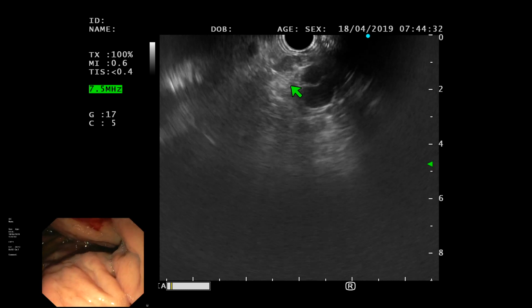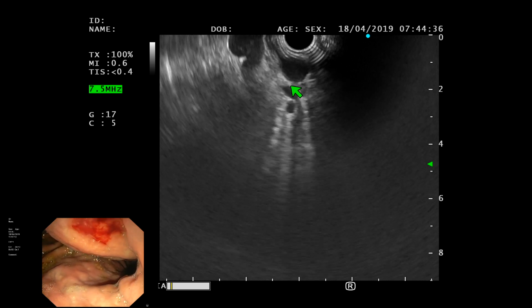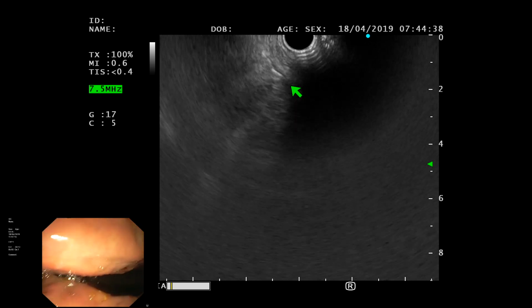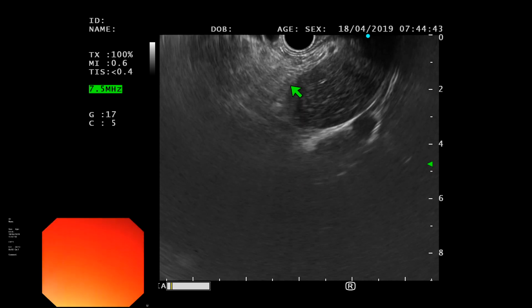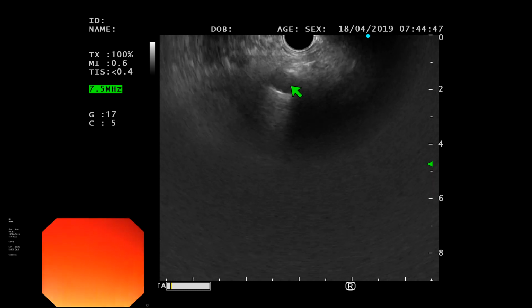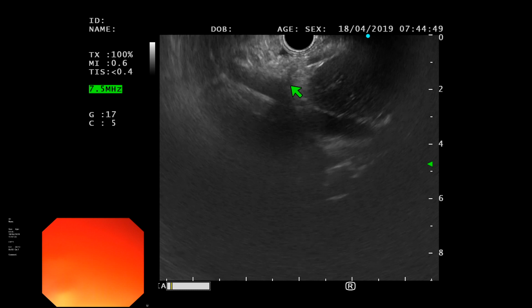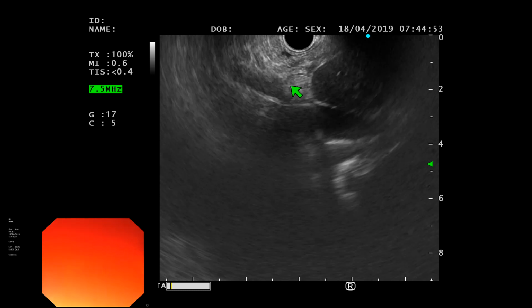You see that? So I have to get, you have an endoscopic view, right? Did you have endoscopic view or no? Can you hear me? Can you hear me?